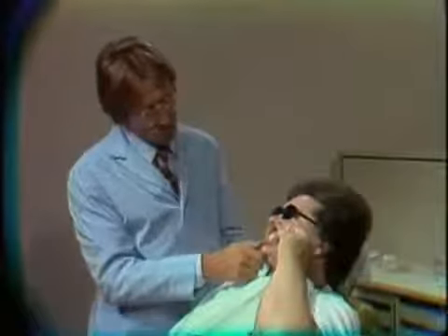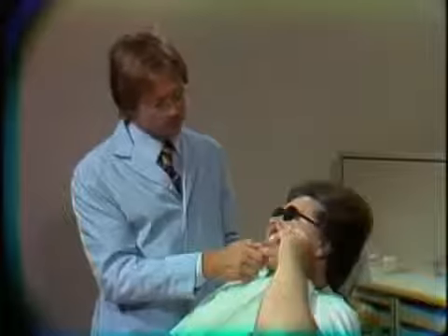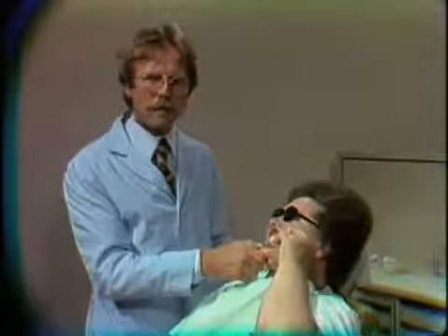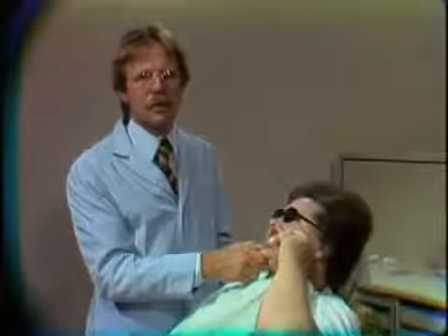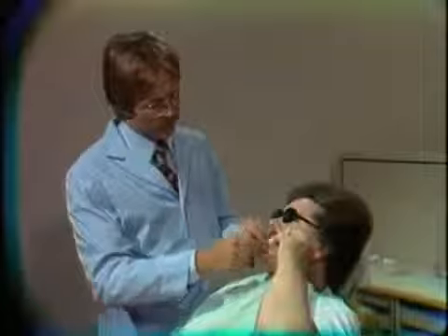Okay, when you are ensured that the patient has made all of these movements, and possibly even having the patient clench together, and if they are bruxers or if they have signs of bruxing, particularly if you let the patient go out into the waiting room to read or do something such as that, maybe a half an hour or so before you take the appliance away from the patient, you may capture a few more of these intraborder movements.